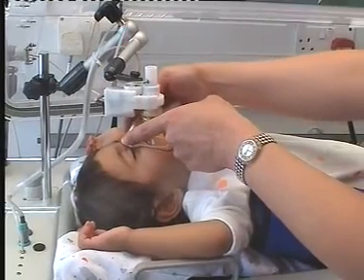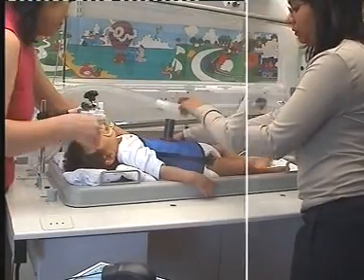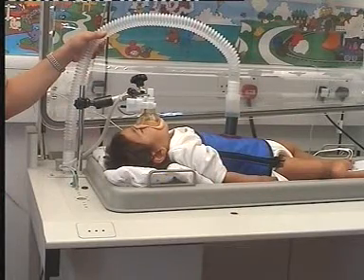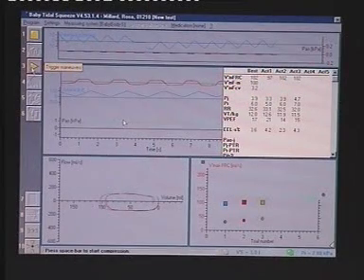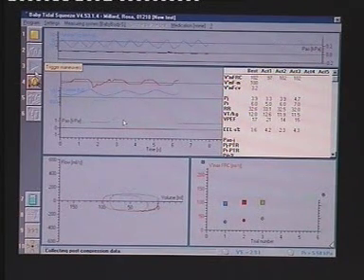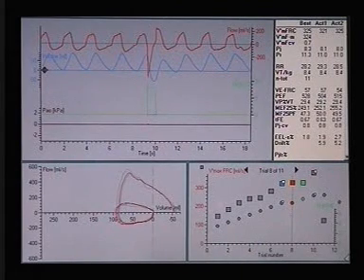Lung function tests in older children and adults usually involve taking a deep breath in and breathing out as hard and fast as possible. In infants, we are able to perform the same test by wrapping a small jacket around the chest and abdomen, which can be inflated at end inspiration to provide a gentle hug or squeeze, thereby forcing expiration. This encourages the infant to breathe out as fast as possible, with flow and volume recorded through the pneumotach. This rarely disturbs the infant. The procedure is repeated several times, gradually increasing jacket pressure until no further increases in flows can be obtained, in order to measure maximum expiratory flow at FRC.